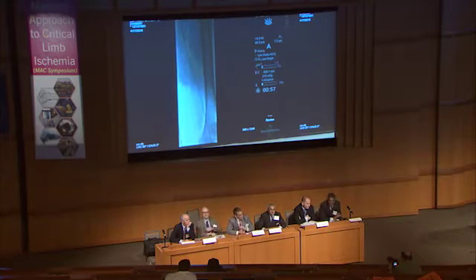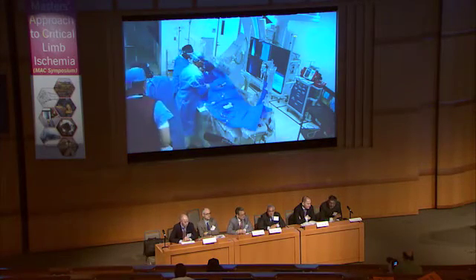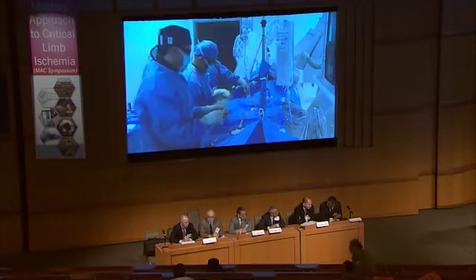Bruce? I'd still like to let him finish the pre-dilatation adequately so that you then get a good selective shot of the SFA and see where the connections are and how many. I had originally thought Viabahn made a whole lot of sense too, because you're not quite concerned about closing off future opportunities to embolize something, since you have a pretty good profunda there if you had to get to some branches. I just want to preempt before the picture and ask our surgeon here: if the connections are beyond the site of occlusion, are we going to also cover those areas with the Viabahn?